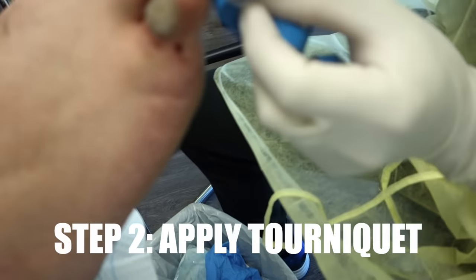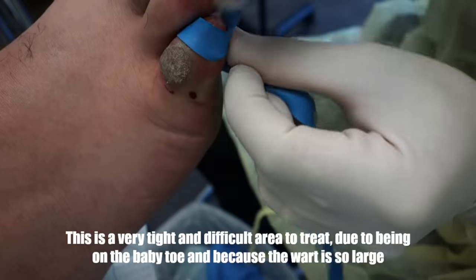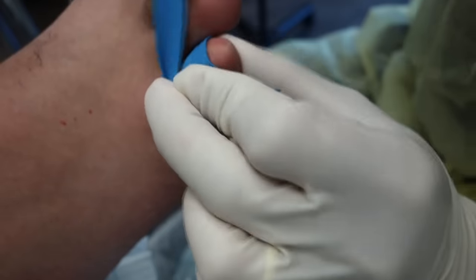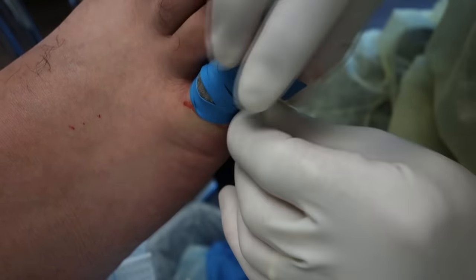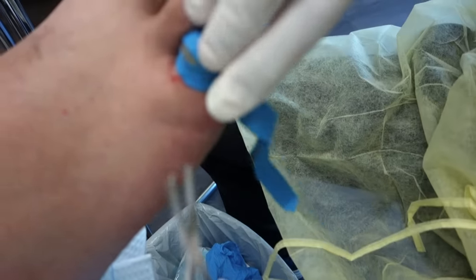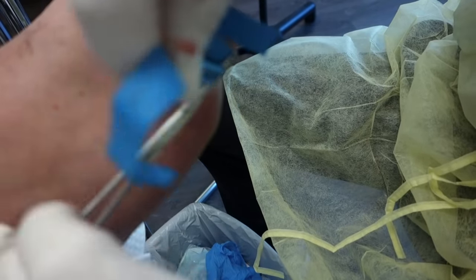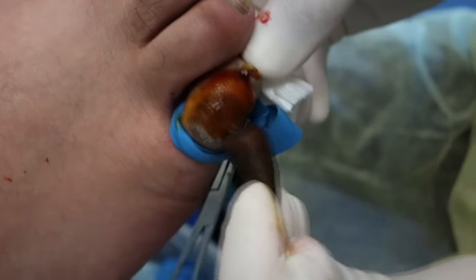We're just gonna put on this tourniquet so there's very little to no bleeding. It's working with a lot of blood, so just watch out if you have something inside. That's why I'm putting this on — to try to reduce how much it bleeds, because a wart is all just blood vessels. If you can hold this spot, that's a good position for me.